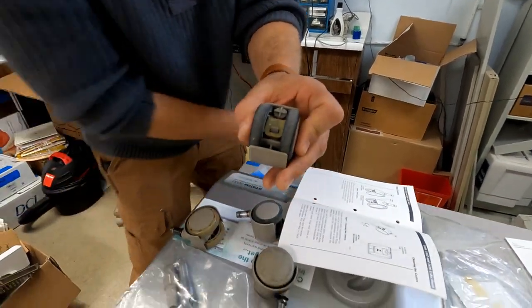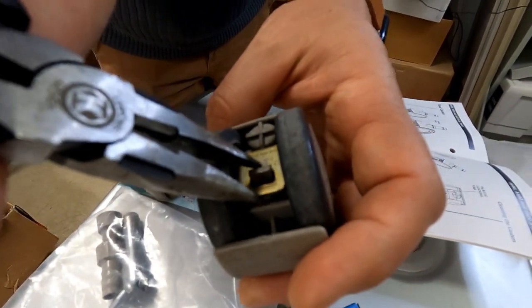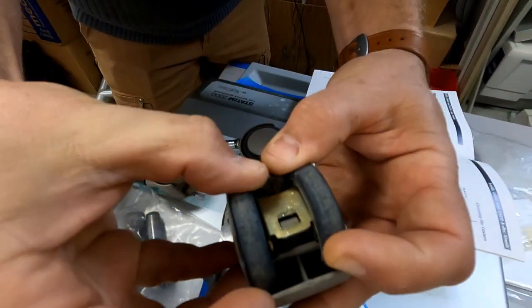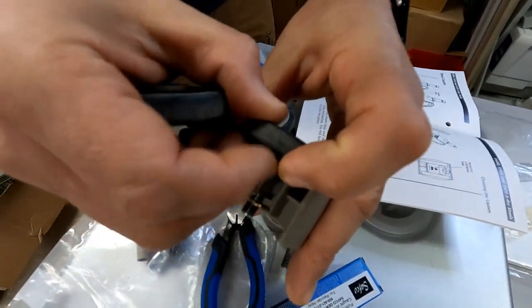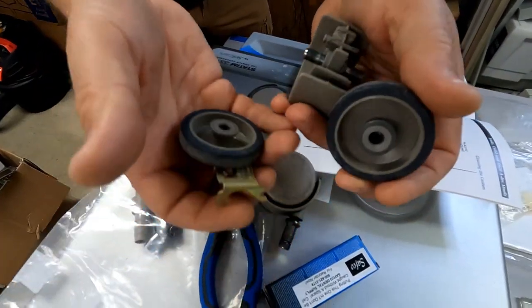Now, I did this as a test a few minutes ago, just to verify it would work. But all we're going to do is take our needle nose pliers, and we're just going to go like that. And then this is just lifting up. And once it lifts up, these wheels, dude, they just come off. Like, this is a magical thing. Okay? Because look, now the wheels just came out. We can clean out whatever we want to clean out of them.